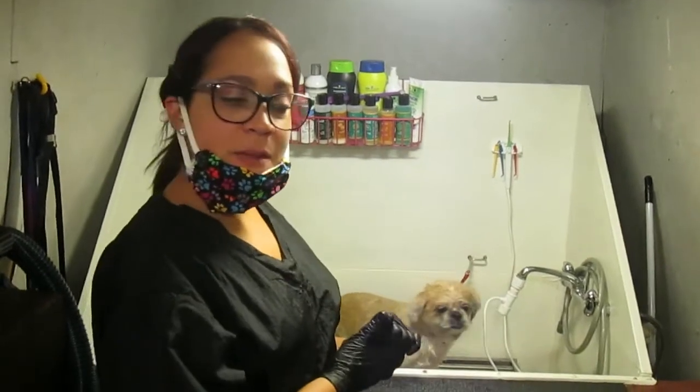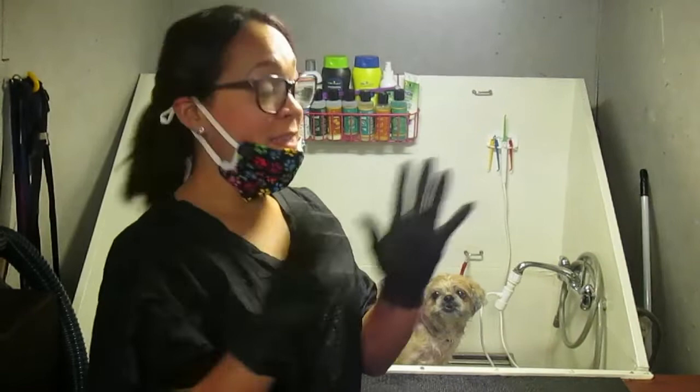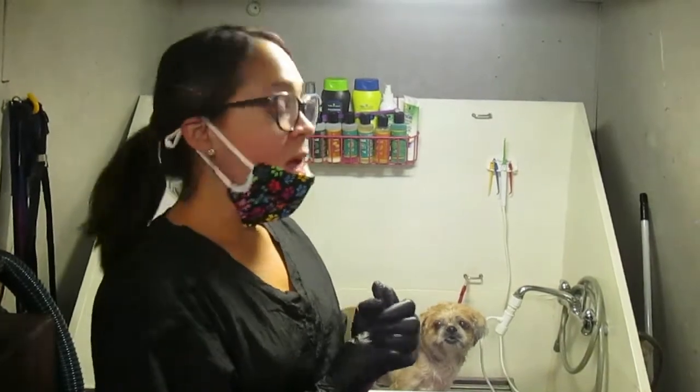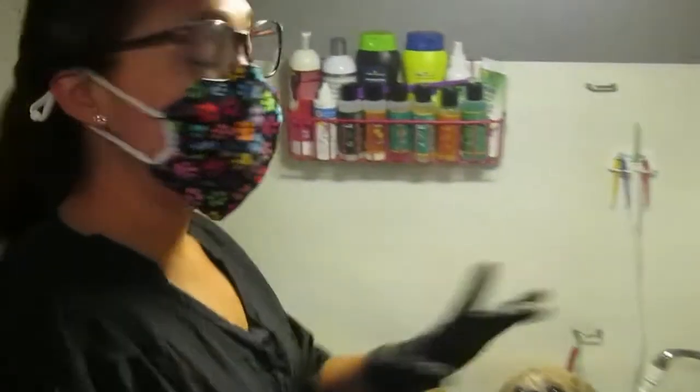Alright, 30 minutes has passed — 30 minutos ha pasado — para empezar con la limpieza. Es muy importante que te protejas los ojos, because there's water splashing all over your face. Y también si puedes proteger tu boca con una mascarilla, just like the dental system at the dentist.